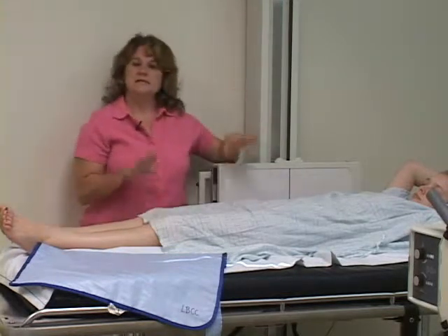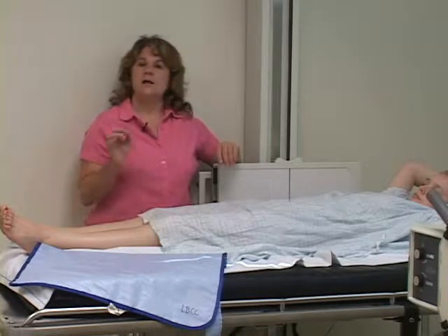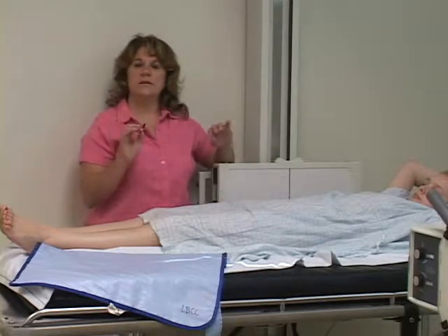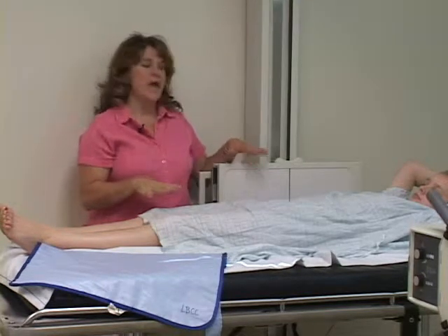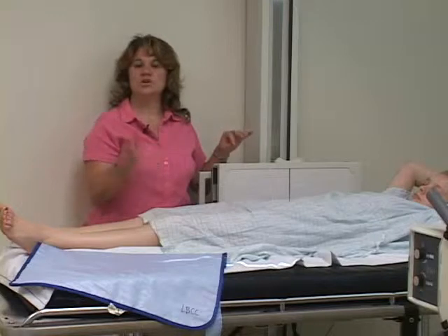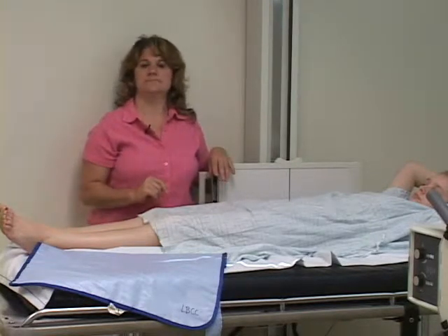And once that is all set, then I'm going to lock my gurney, and I'm going to tell the patient that I want them to take in a deep breath. I'm going to have them blow it out, and I'm going to take the exposure on expiration. That's a dorsal decubitus.